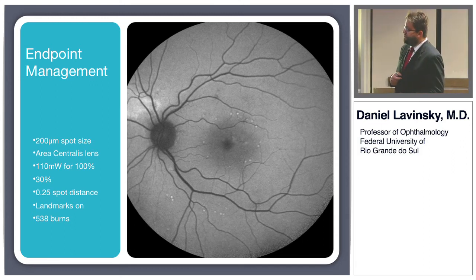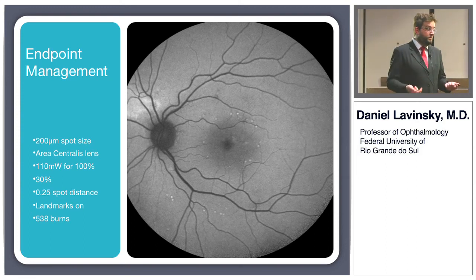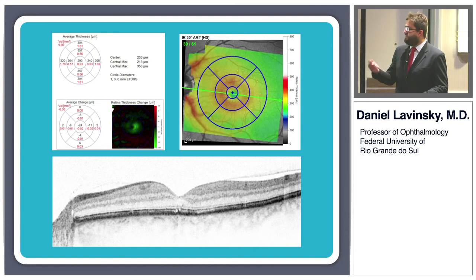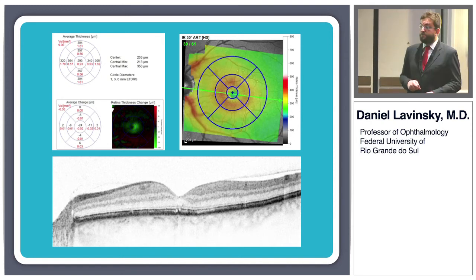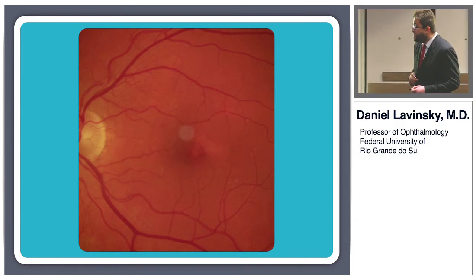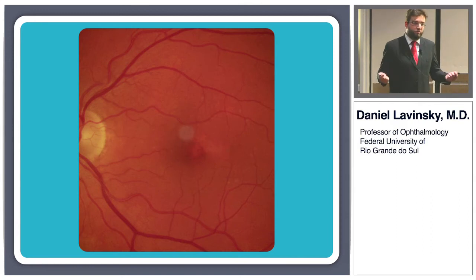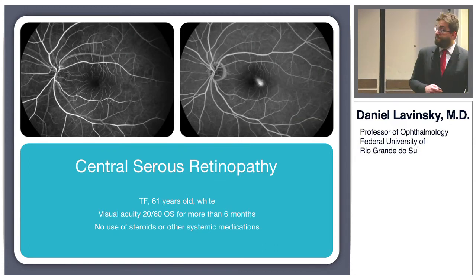When I don't see any burns like these inside the grid, it's because I'm using 30%. And that's after, I don't know, 1 week, maybe 1 month, but this is the complete resolution of the fluid after the treatment with endpoint management. And this is the color fundus picture, and we might see some of the landmarks here. Sure, not a scar, not something that people will notice if you don't tell them.